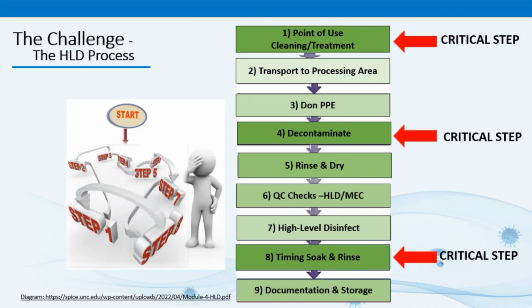In step 8, that's soak and rinse, they observed not removing items from the solution when the disinfecting time has been reached. And in step 9, documentation and storage, they saw not documenting cleaning and disinfection in the designated log and not storing devices in a way to prevent damage or keep them clean. So with so many steps within this HLD process and the challenge of knowing what, when, and how to do each step, it's no surprise surveyors have findings.